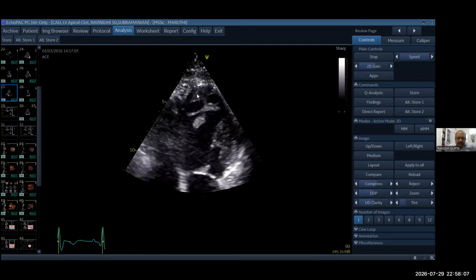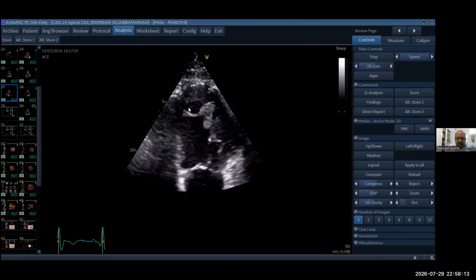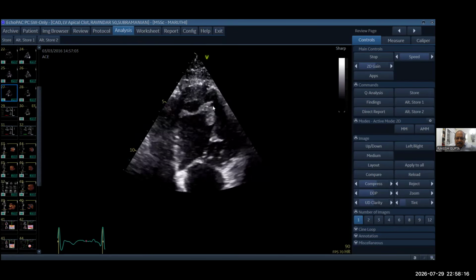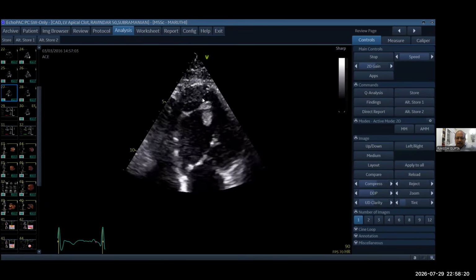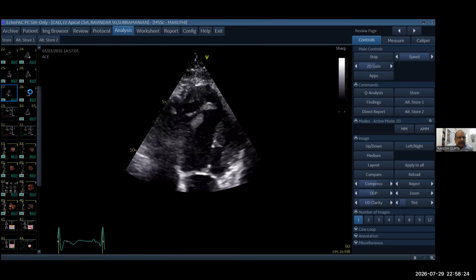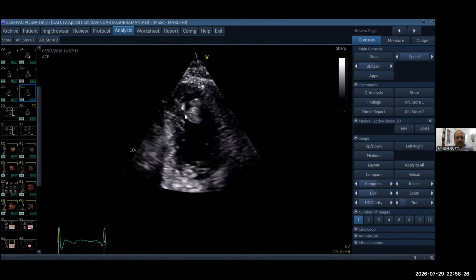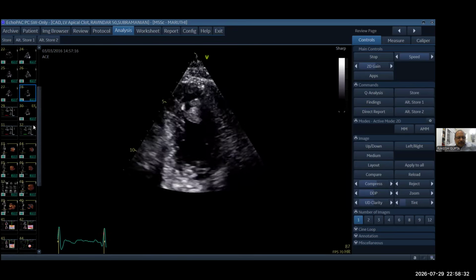This whole segment has a soft plaque, which is a thrombus that has formed. In between, you can see this hyperechoic shadow. Then this is another accessory band, with which this thrombus is hanging on from this particular margin. Now you can see this very clearly. So this is attached to the anteroapical segment, a pedunculated thrombus.